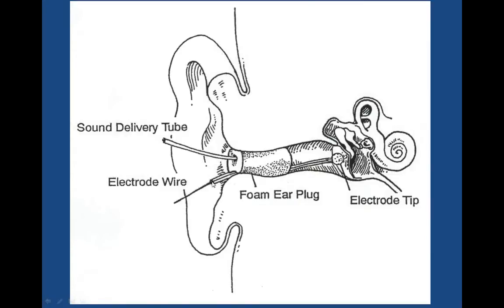And I normally use the smaller of the two diameters of the earplug to do that. The other end of the electrode, of course, is connected to the preamplifier, and once the patient acknowledges that they have contact with the TM, the other way I have of verifying that is I look at the raw EEG on the face of my evoked potential unit, and if that's relatively stable, non-cyclic, no peak clipping, etc., then chances are I've got good contact.